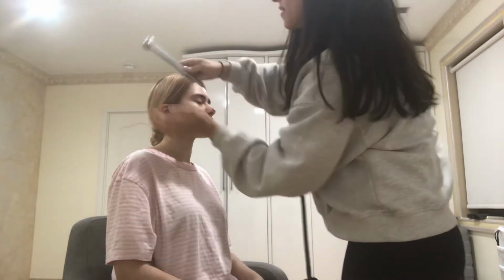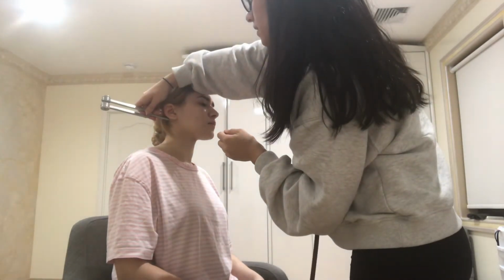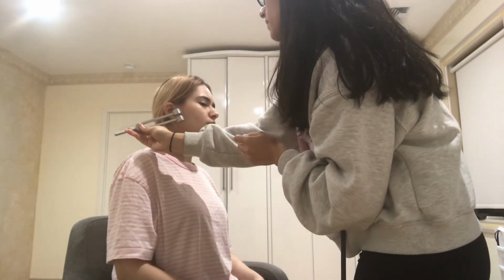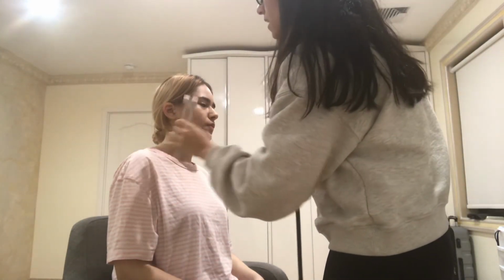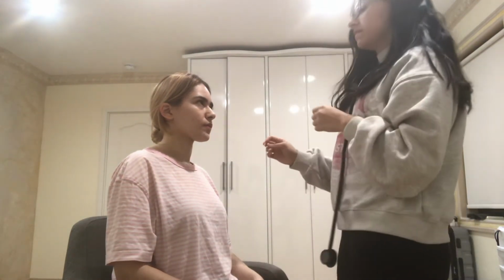And now we will do the Rinne test. Okay, now please tell me when you stop hearing the vibration. Okay. And now tell me when you stop hearing it. We are checking for air conduction versus bone conduction, and the air conduction should be greater than bone conduction, which is a normal finding.